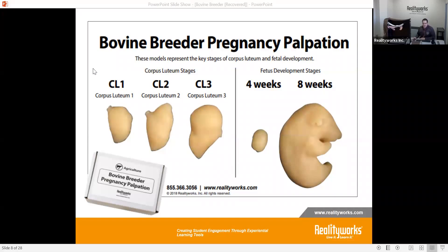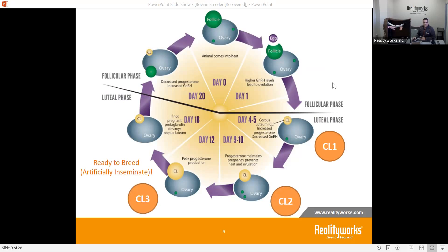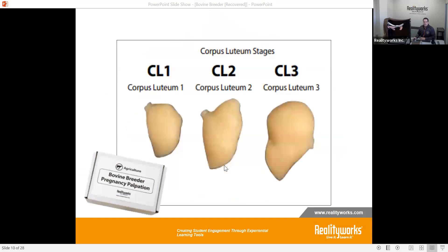Here we have the different options for corpus luteum stages and fetal development stages. The corpus luteum allows you to test if the cow is ready to be inseminated with CL1, CL2, and CL3 based on what you put in. These examples of CL1, CL2, and CL3 are blown up here in the photo, giving you an understanding of what they look like and the texture and size for this product.